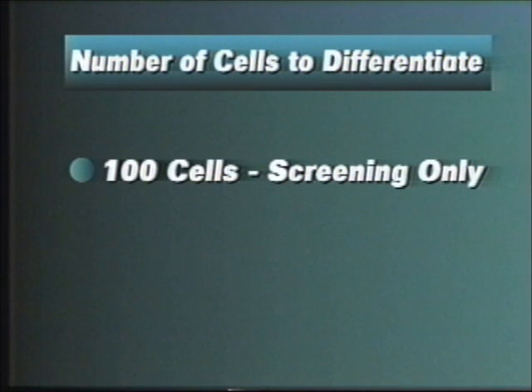Some authors will say that a certain number, such as 150 to 200 red blood cells, are necessary for a good area to count. This is good if the patient's red count is normal. Once the patient's red count is outside the normal limits, then this is not an acceptable way to evaluate a slide. That's why it's so important to know when you have good white cells. Historically, we have always started with a 100-cell differential, and we believe this is still true if you are looking at every slide.